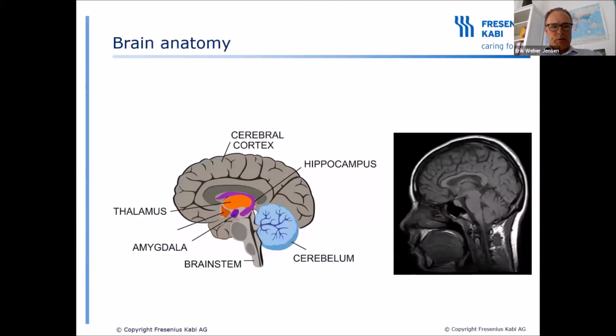So what I first wanted to show here is a picture of the brain anatomy, and from where we record the EEG when we put electrodes on the forehead of the patient. Most of the signal that we record is coming from the cerebral cortex, as we position the sensors frontally on the patient. We do get some signal from lower subcortical areas as well, such as the thalamus or the insular cortex, which is important as well in terms of nociception monitoring.